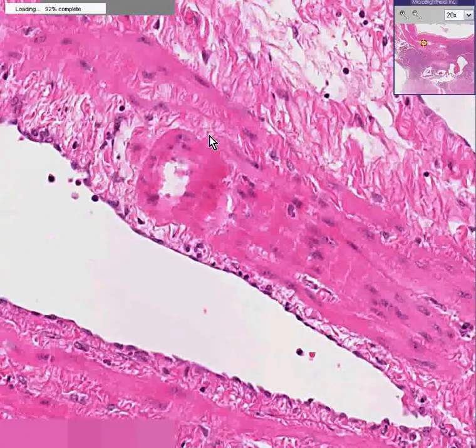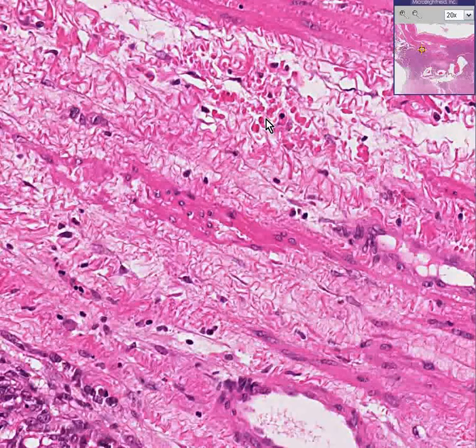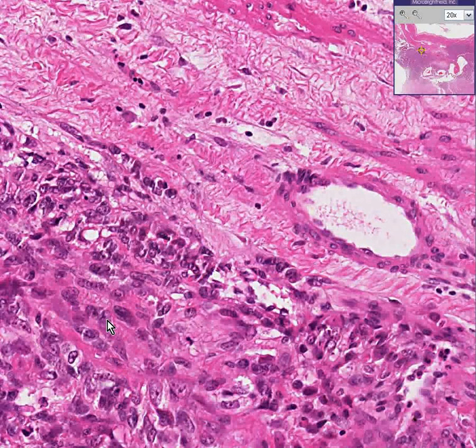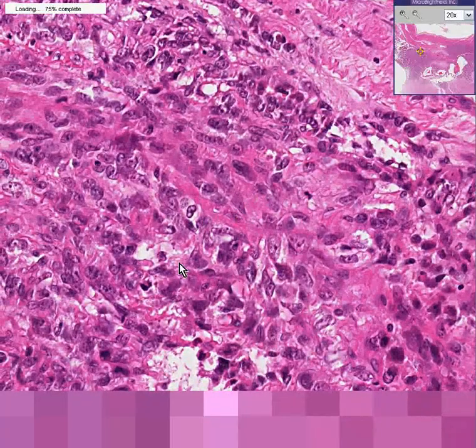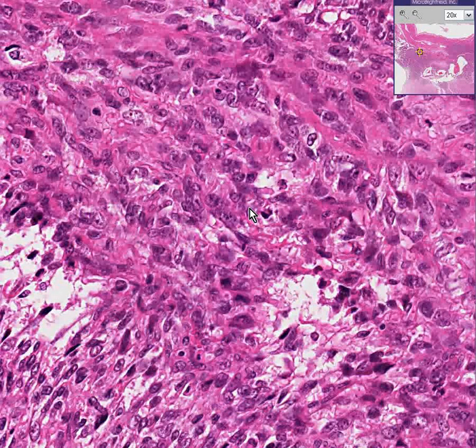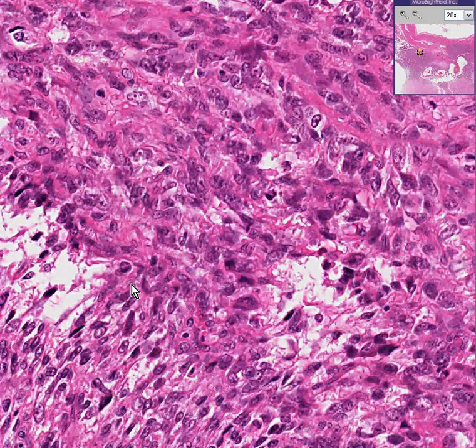If we move to one of those nodules that looked funny on the gross specimen, we can see that they may show some semblance to smooth muscle, but their nuclei are a lot bigger compared to their cytoplasm compared to the normal surrounding smooth muscle. Notice we have a feature called pleomorphism and hyperchromasia. But pleomorphism and hyperchromasia don't mean a damn thing when it comes to evaluating smooth muscle tumors. The only important thing — and usually the only important thing in connective tissue tumors in general — are mitotic figures.